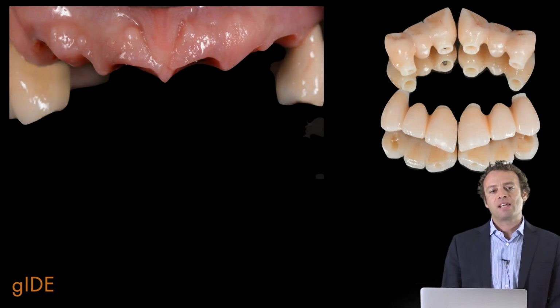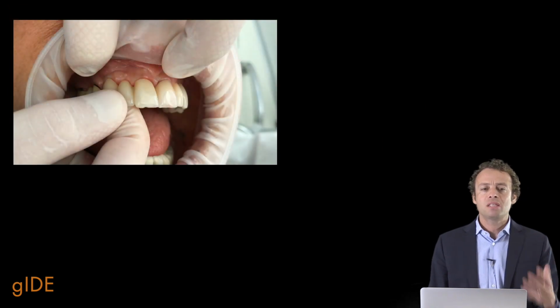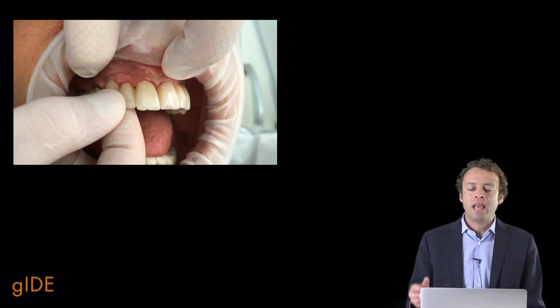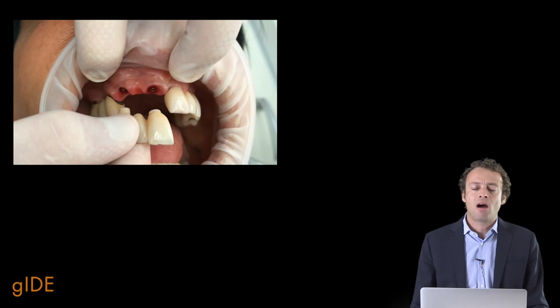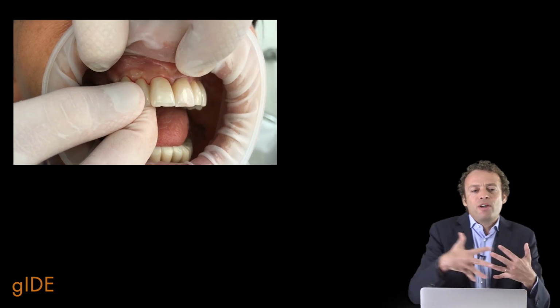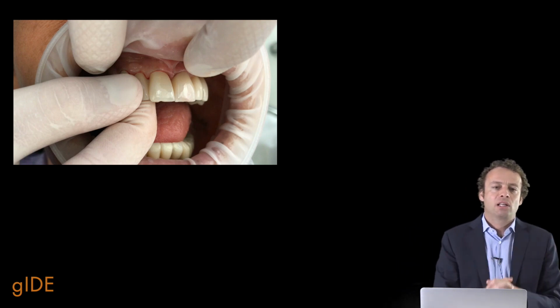And now we finalize the treatment, we do our layering approach on the buccal aspect, and now I want to show you the seating of the bridge in the mouth with this kind of technique. You can see how when I try in the framework and the bridge in the mouth, we don't have any kind of ischemia. The framework and the bridge gel perfectly with the soft tissues. We have a perfect blending, and the framework and the bridge don't require any kind of adjustment.